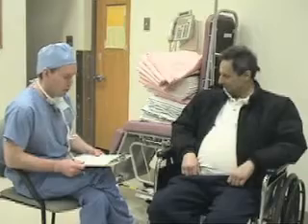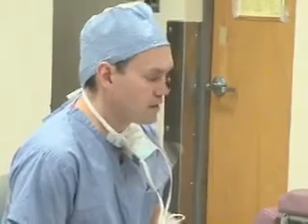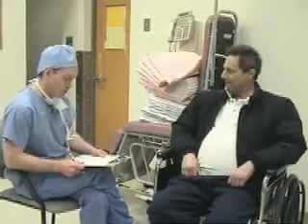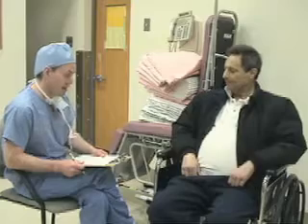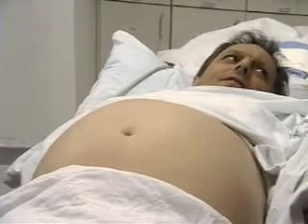Explain the procedure to the patient and obtain informed consent. Risks of bleeding, infection, intra-abdominal organ injury, and post-procedure hypotension should be discussed. Position the patient supine in the bed with the head slightly elevated.